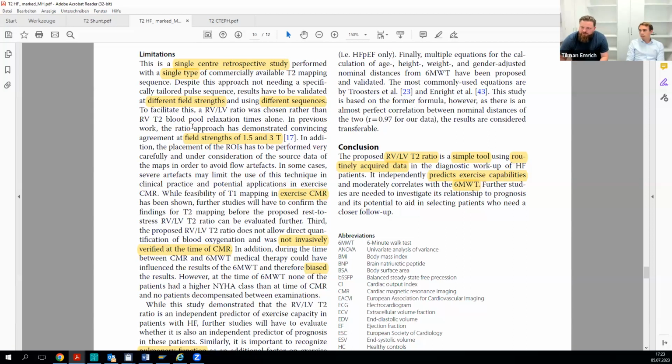So actually, we are doing that at the moment together with our friends in Rome, who run an interventional CMR business and have catheters for blood oxygenation in the right and the left heart. We are performing a study where we try to correlate for that. It's also getting more and more complicated. If you look, for example, at patients that have coexisting pulmonary disease, that may confound these results. We did not stratify for that yet, but we need more data and more outlook to really know if this very simple sign is really accurate.